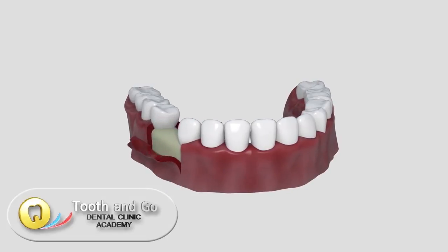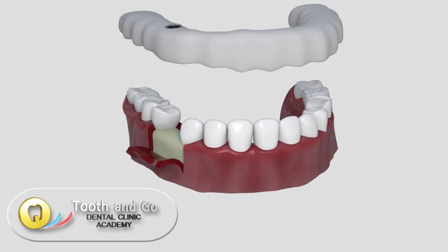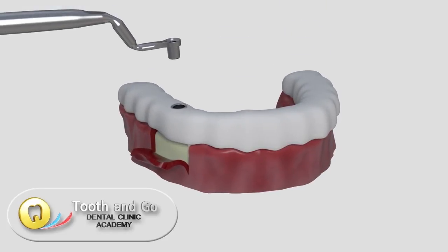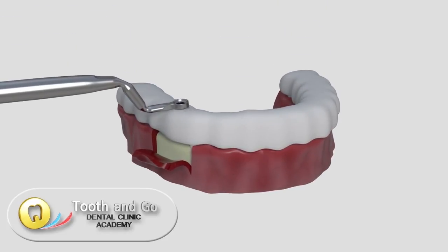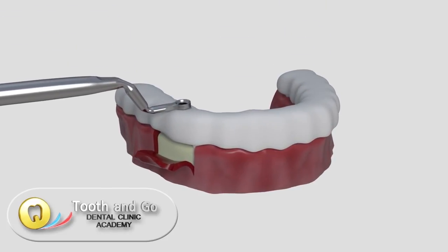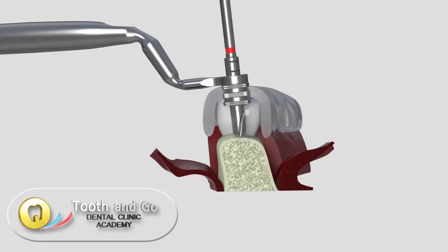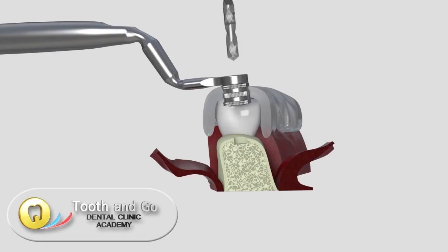The implant surgeon can then use the drill guide to perfectly place the implants, based on our virtual planning.